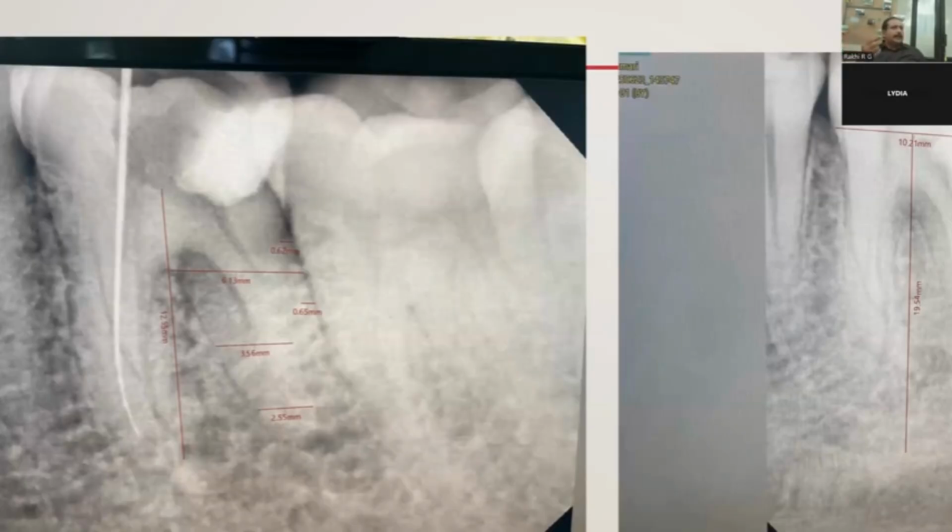You're going to connect these two teeth, I mean these two portions you're going to connect. The other one you're not going to connect. You understand? The portion which you're going to connect would require a lesser amount of prosthesis material than the other one.